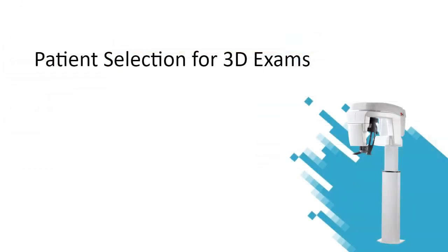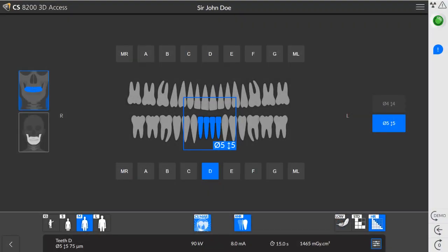Patient selection for 3D exams. These settings are for all 3D exam types. On the main interface, select the patient's head size: child, adult small, medium, or large. When you select the appropriate head size, the KV and MA are adjusted automatically. Your selection adapts exposure settings to maximize the image quality for specific patient morphologies.